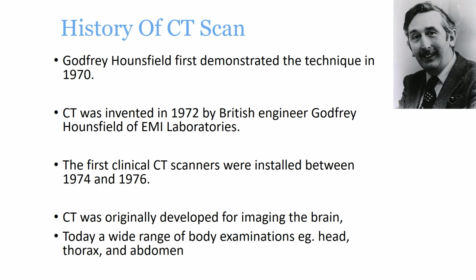The credit of the invention was given to Godfrey Hounsfield in 1972, and the CT scan was first installed for clinical purposes between 1974 and 1976.